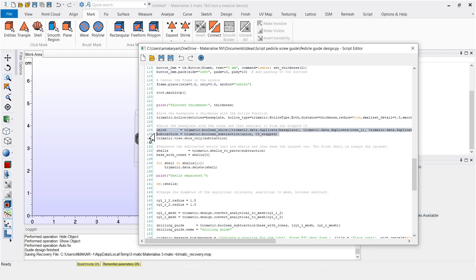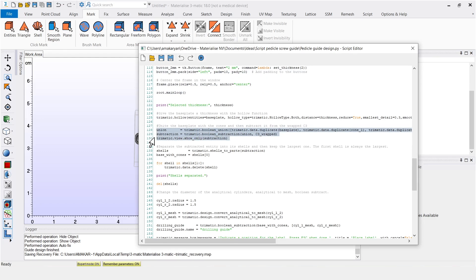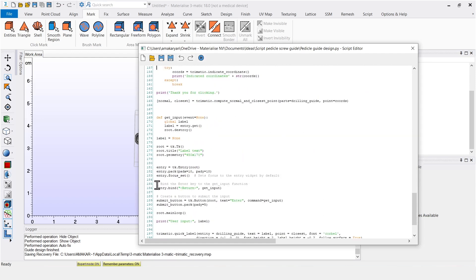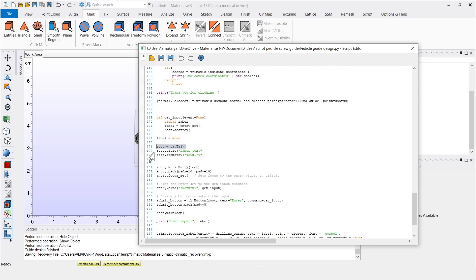Here we add the cones to the base plate and below that we make the cylinders that are used to make holes in the cones. This is where the location for the label is indicated and here is where the small text box is made for the label.